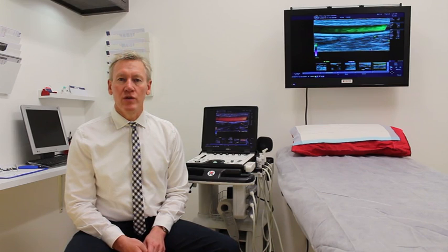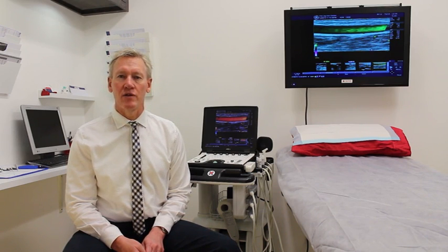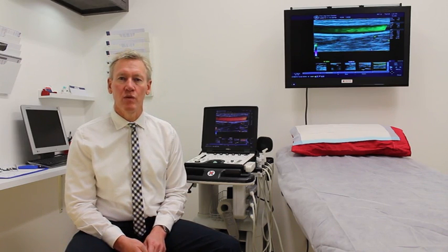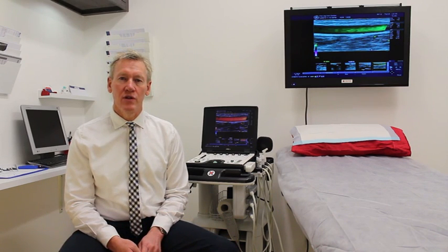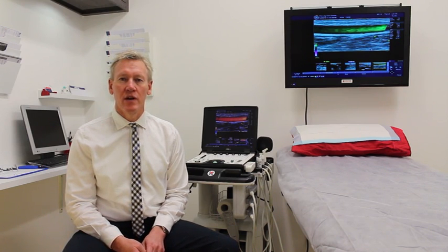So initially we use ultrasound to do a complete mapping of the venous system in a patient's leg. We look at the superficial veins and we look at the deep veins. The deep veins are the veins that do most of the work in clearing the used blood out of the leg and returning it back to the heart. This occurs when you walk. Your calf muscles contract and compress the deep veins and push the blood up.